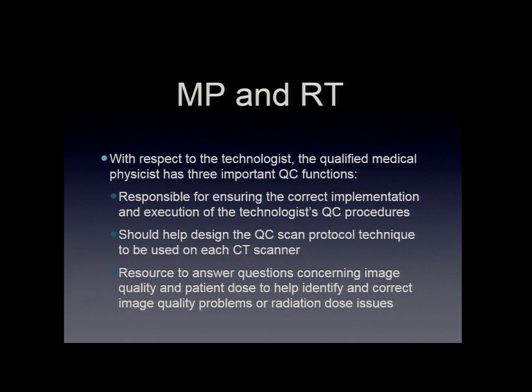Also, when we go in and train them, we will actually set up the protocol that's sufficient to obtain a successful QC program on each scanner, because if they have CTs from different manufacturers, you may have to have different protocols. As you know, when Keith was talking earlier, he was talking about how on one scanner you can get the same CNR with different mAs and you get the same dose, because there are different geometries, different filters involved, and different spectra that come out of the scanners.